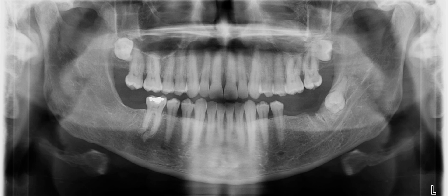Obviously, we're seeing these three impacted third molars, but if you look carefully, the angulation at which these have been impacted are different from one another. Let's start with tooth number one — where is the direction of the roots, or where are the roots if you can see them?